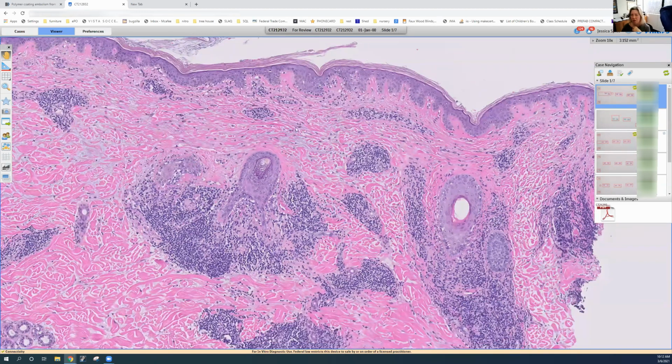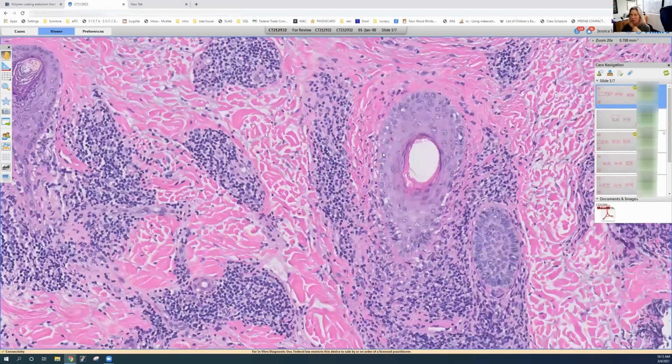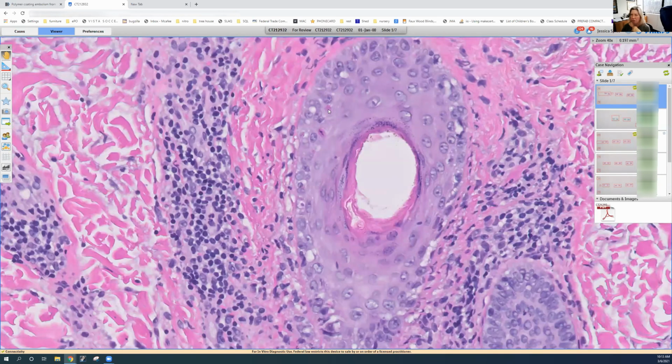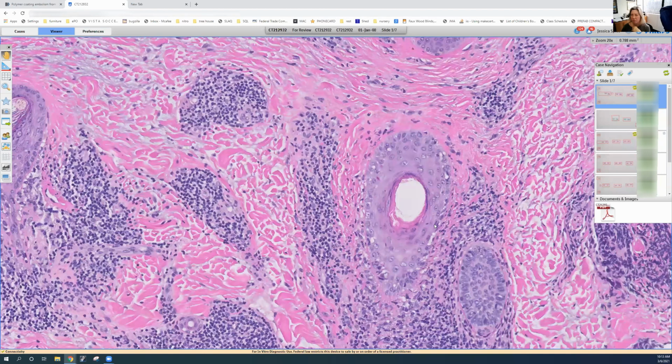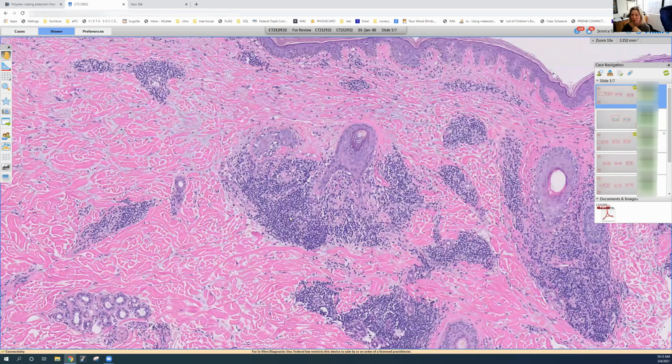And then in the dermis, we have a superficial and deep perivascular and perifollicular infiltrate. Here are more of these changes we saw at the DE junction, even more prominent in the follicles. Here we've got necrotic keratinocytes, or follicular epithelial cells. This kind of bubbly vacuolar change. So we've got an interface dermatitis here, also on the follicles. Some of you have guessed the diagnosis already.